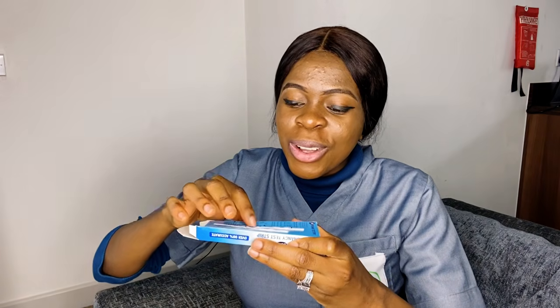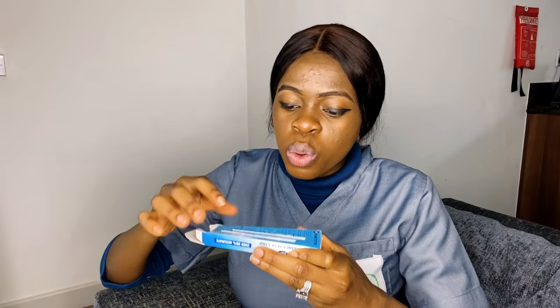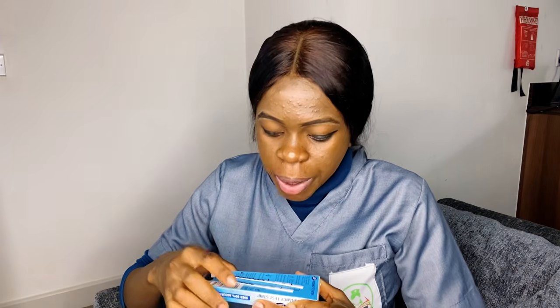So I had to get this pregnancy test strip because of this video. So who will pay for the pregnancy test strip that I use? I have two here. Generally, in the cartons, they'll tell you results in 5 minutes. Yeah, results in 5 minutes. Urine HCG test, this and this, that and that.